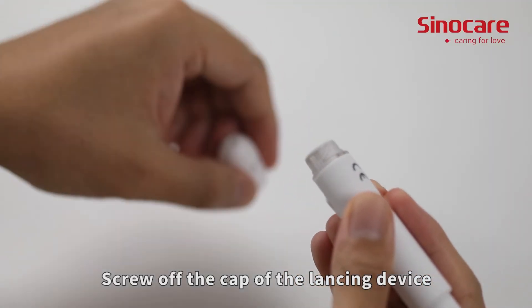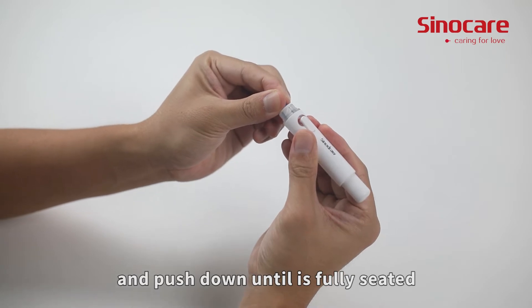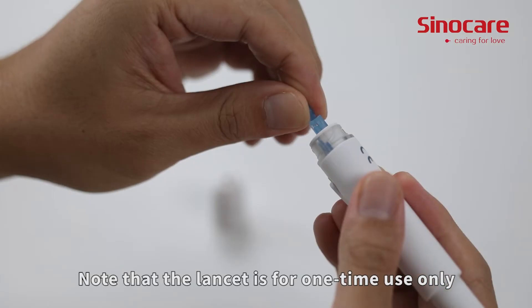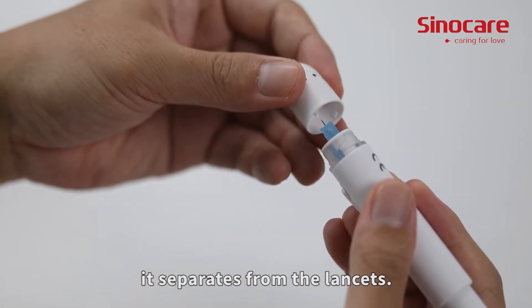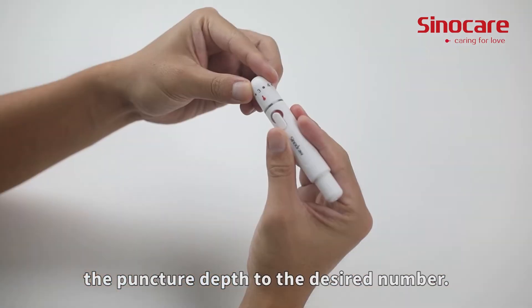Screw off the cap of the lancing device, insert the lancet into the lancet holder, and push down until it is fully seated. Note that the lancet is for one-time use only. Twist off the protective cap until it separates from the lancet. Replace the lancing device cap and set the puncture depth to the desired number.